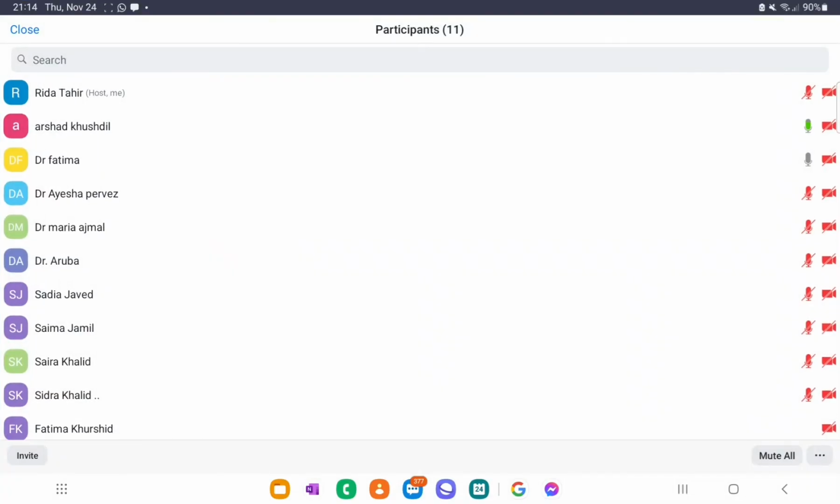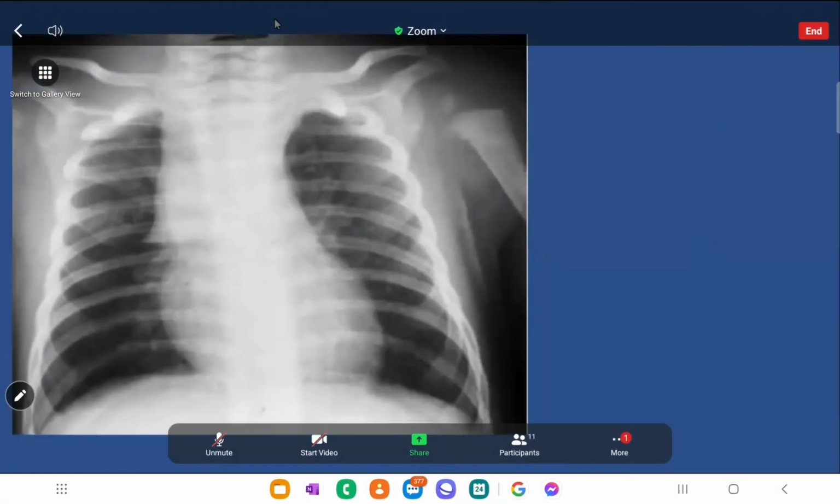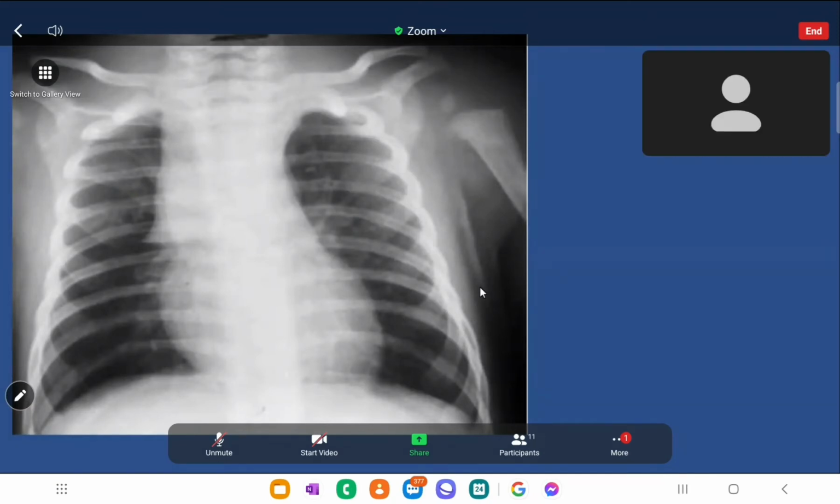So anyone who can comment on this X-ray? Am I audible to all of you? Yes, sir.